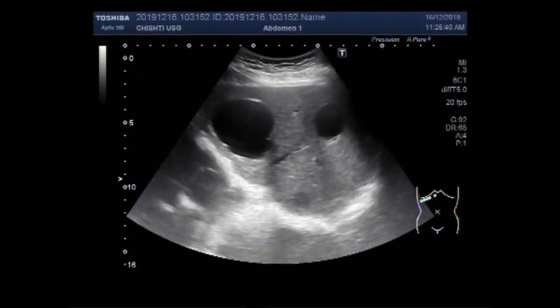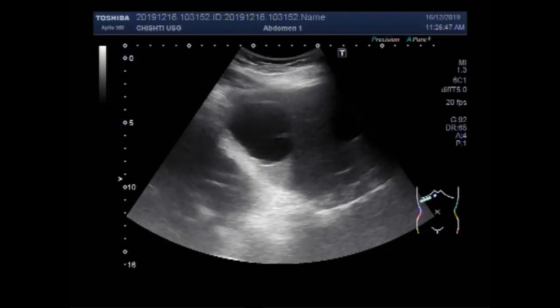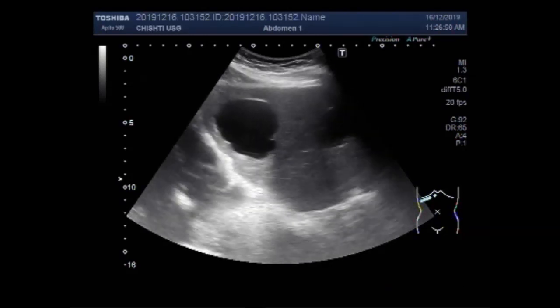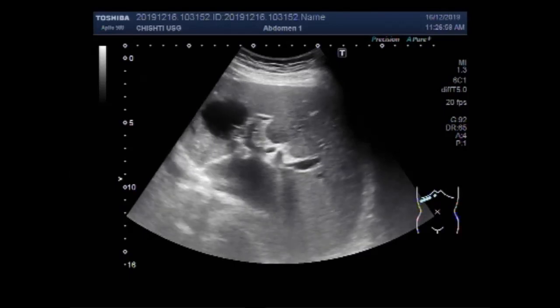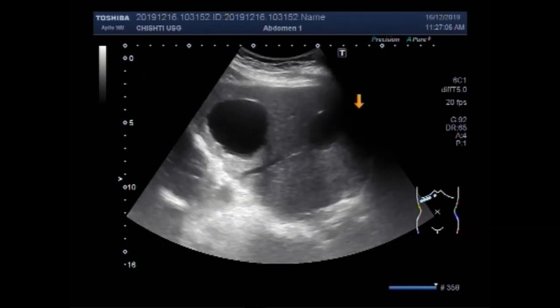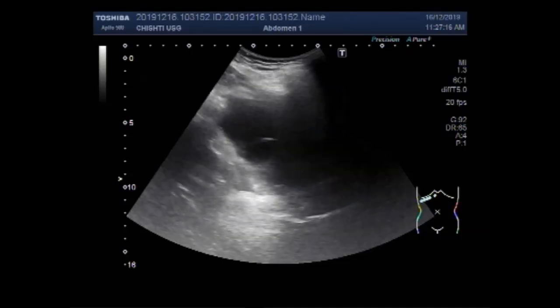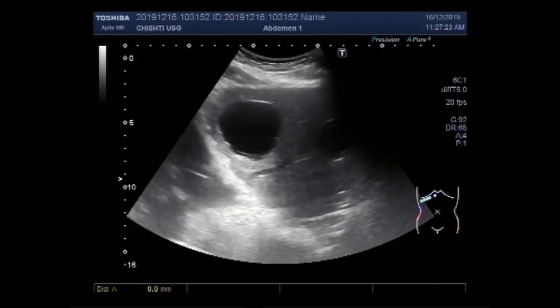Dear viewers, I hope you are all fine. This ultrasound video shows scanning of the liver. You can see there are two hydatid cysts seen. The larger hydatid cyst is seen in the upper portion of the left lobe of the liver, while the smaller cyst is seen in the middle portion of the right lobe. The cyst is round to oval in shape and has clear fluid in its interior. The outline membrane is well defined.